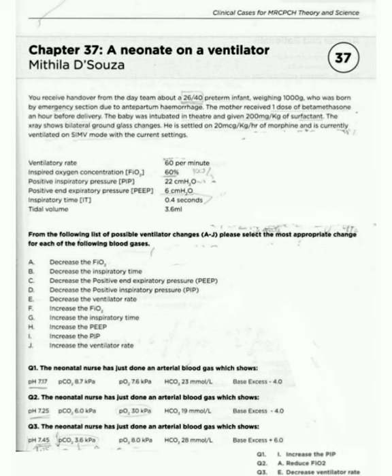Now, from the following list of ventilator changes A to J, please select the most appropriate change for each of the following blood gases. So, we choose the appropriate change for these cases.